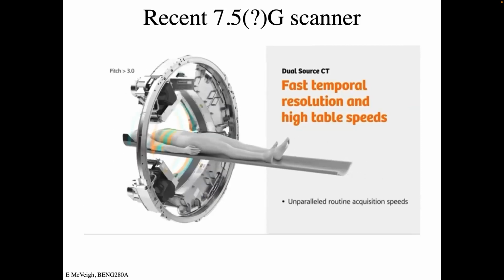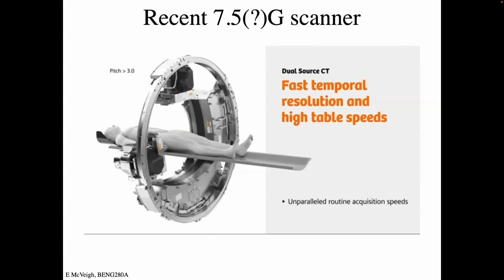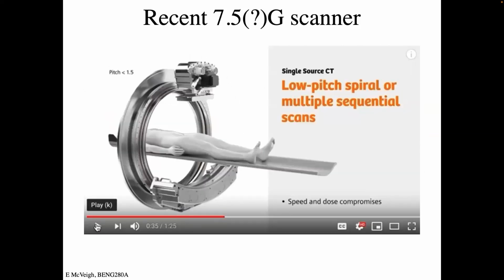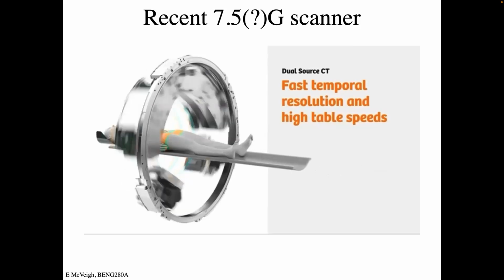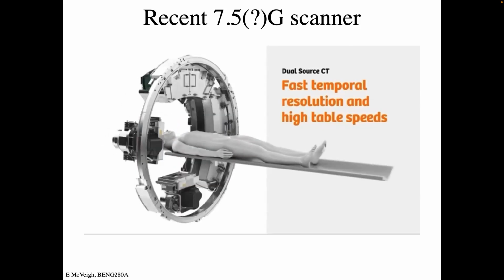And then if you don't have enough X-ray power, you can slow the thing down such that you get enough X-rays per unit time to make the picture. But when it's really gunning, they can go that fast, right? And so I've been in this scanner going that fast, and it's pretty interesting actually.